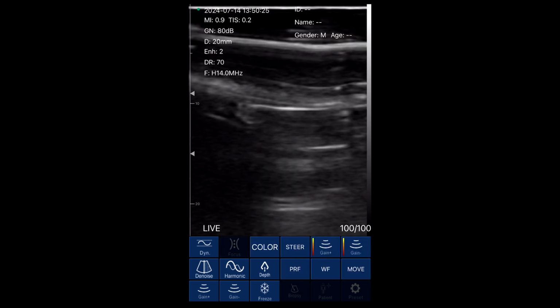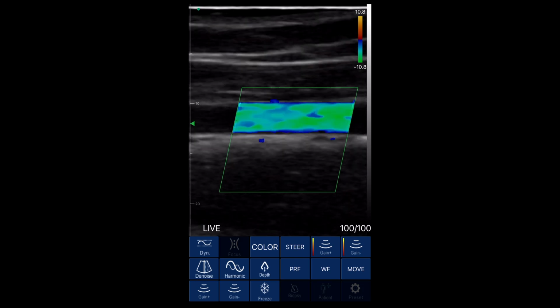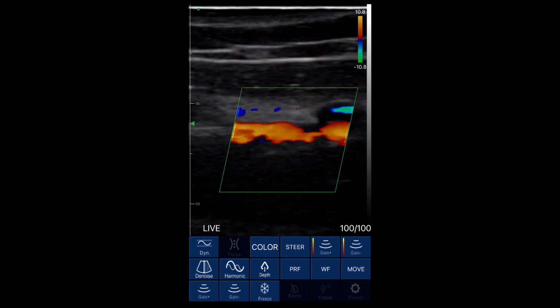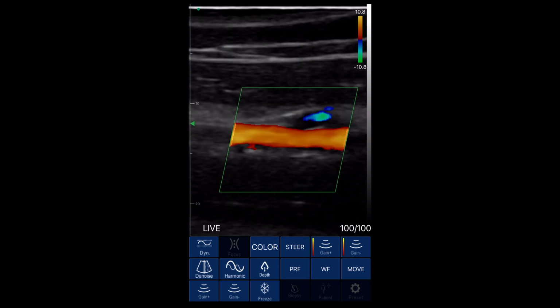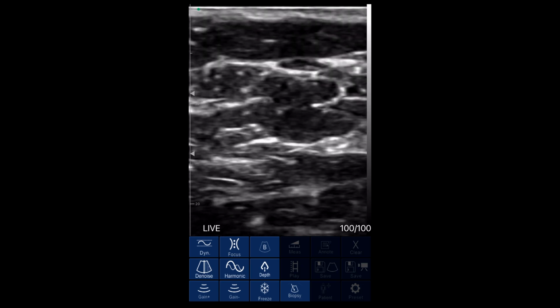And I want to show you as well what this looks like with color Doppler on. So here you can see the vessel. It's lighting up beautifully. It's picking up that flow, and I'm going back and forth again between the artery and the vein. Next, I want to show you what this is going to look like on some breast tissue.